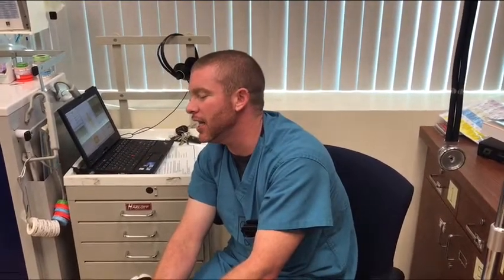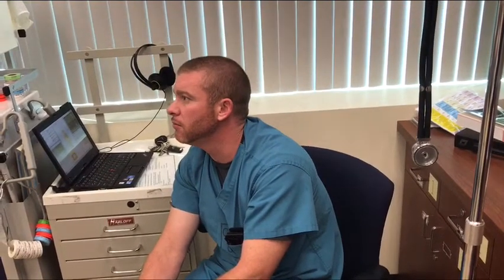Okay. I want you to emerge the patient. You're about 20 minutes out. In fact, I'll be a kind surgeon. Hey, Liviu, gallbladder's out. Thanks for flattening the patient. We're going to start closing up. We got about 20 minutes till we'll be done. So we're just going to turn my gas off. So go ahead and emerge that patient.